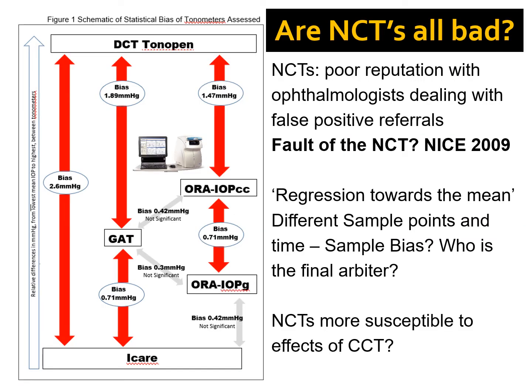So the question people pose always is, are all NCTs bad? Or they might not phrase it like that. They might say, all NCTs are bad. And certainly NCTs have a poor reputation with ophthalmologists dealing with false positive referrals. And it must be frustrating. But is it the fault of the NCT? Or is it perhaps the fault of how some optometrists responded to the 2009 NICE guidelines?